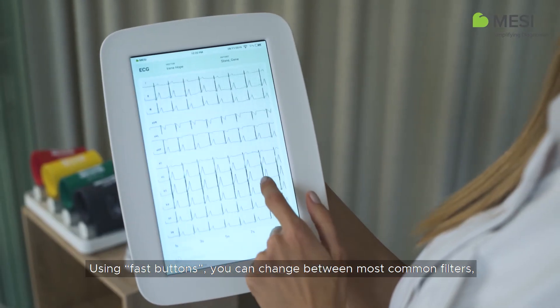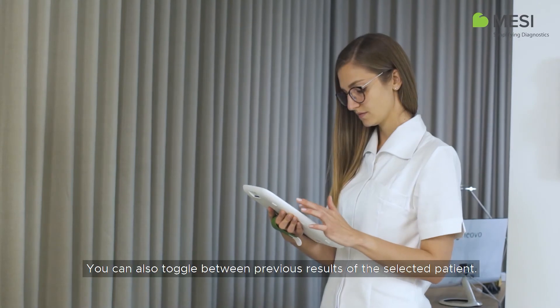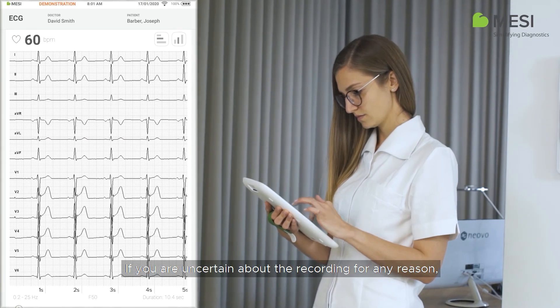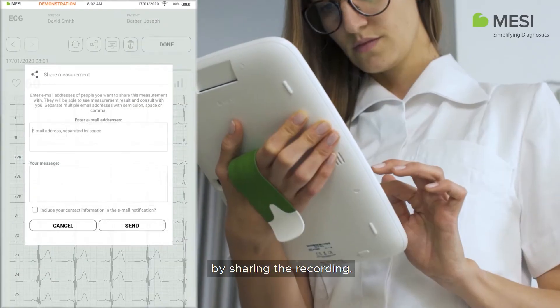Using fast buttons, you can change between the most common filters, recording speed and sensitivity. You can also toggle between the previous results of the selected patient. If you are uncertain about the recording for any reason, you can easily repeat the measurement or consult with a specialist by sharing the recording.